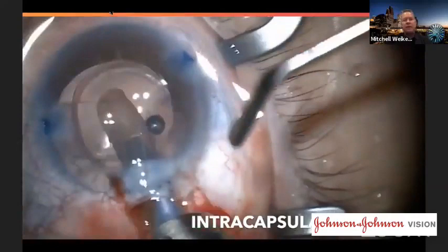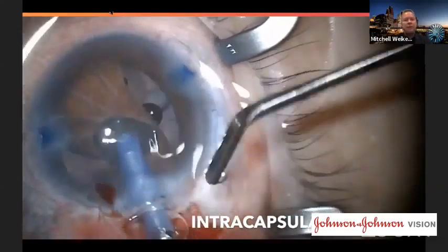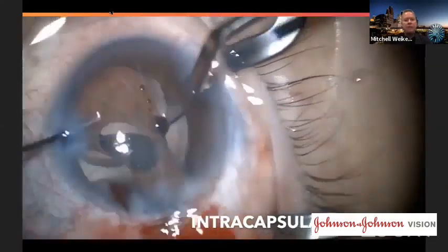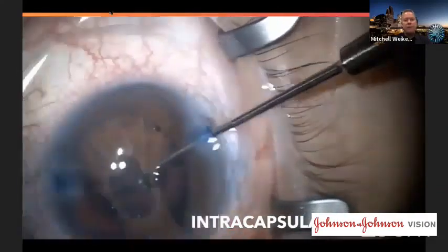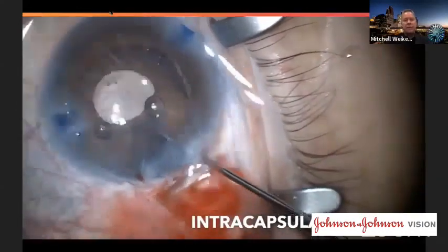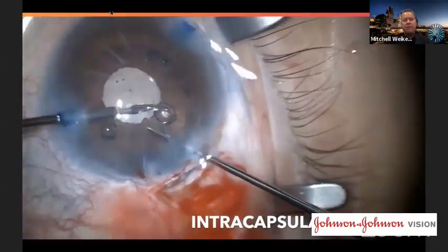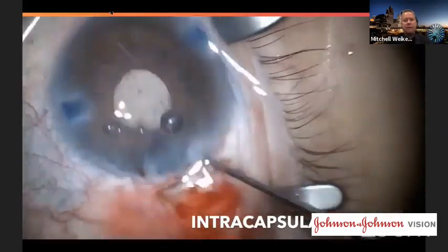So we're injecting this in, so you can see we can do this through a 2.75 millimeter incision. This is one without meshwork. It takes a little bit of effort to get this open. We're gonna massage it with a second instrument. And what we'll often need to do, or what we really need to do in each case, is come in with forceps. And we're gonna use forceps to pull it toward the center and actually twist the forceps to decrease the diameter 90 degrees to the axis that we're trying to implant it. And it can require multiple iterations here to get this in. And you're using a second instrument to try to slip it under the capsule edge.